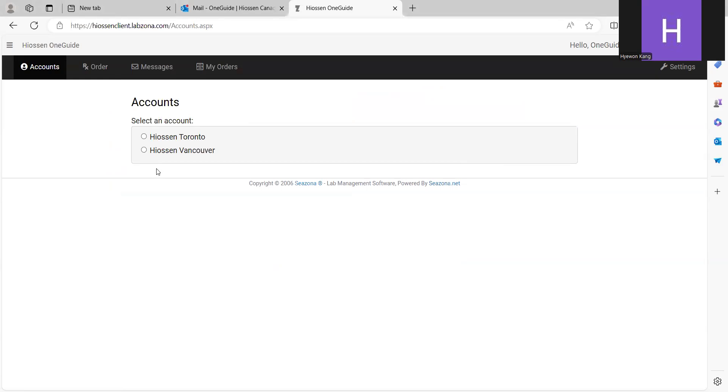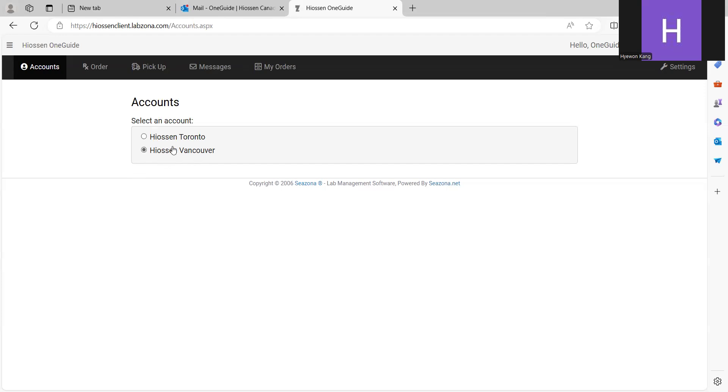Before placing the order, I need to select the clinic where I want to receive the case. I want to receive the case to Hyosan Vancouver clinic. If I click the Vancouver Hyosan clinic, the order will be placed under the Vancouver clinic account.